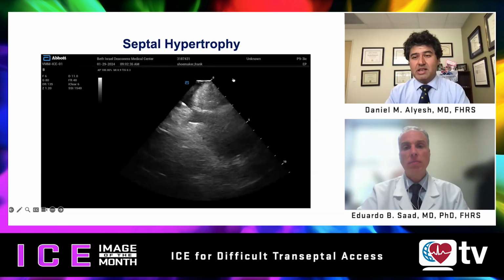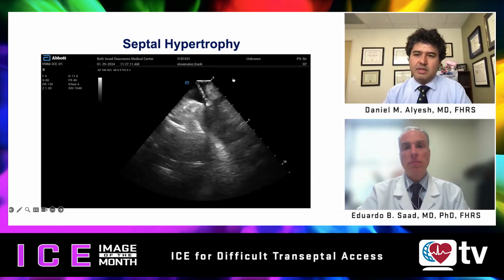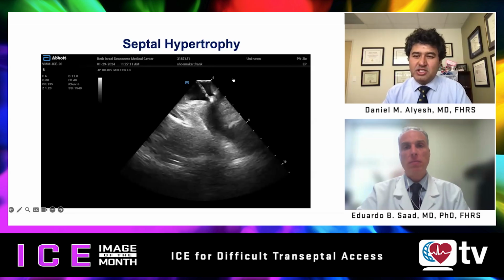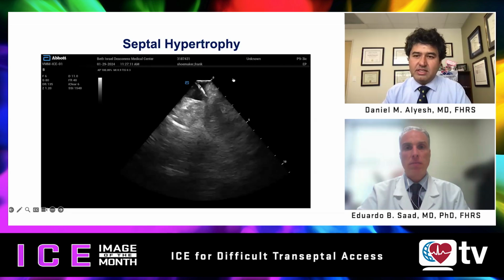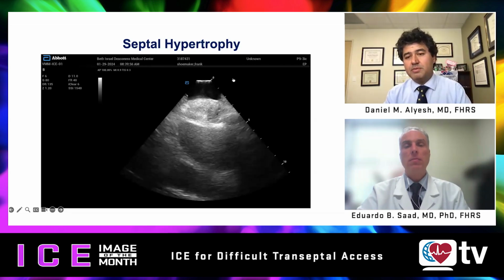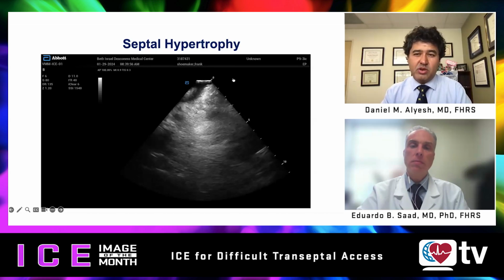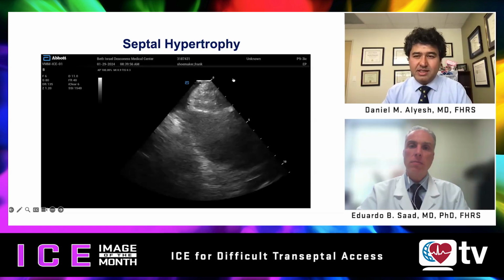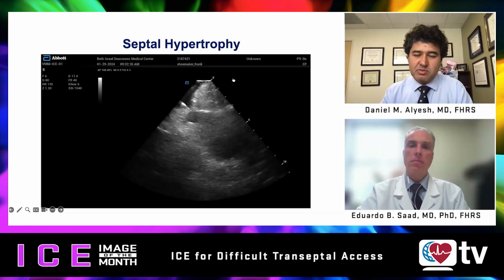I completely agree. A couple comments on what you just said, which was just beautifully said. Number one, cost containment and consciousness is also a concern here in the United States, and something that we need to think about, especially in the era of PFA. And number two, just based upon your own story, right? Seeing the value of ICE, this segment is an example, right? Seeing the value from a safety and efficacy perspective.